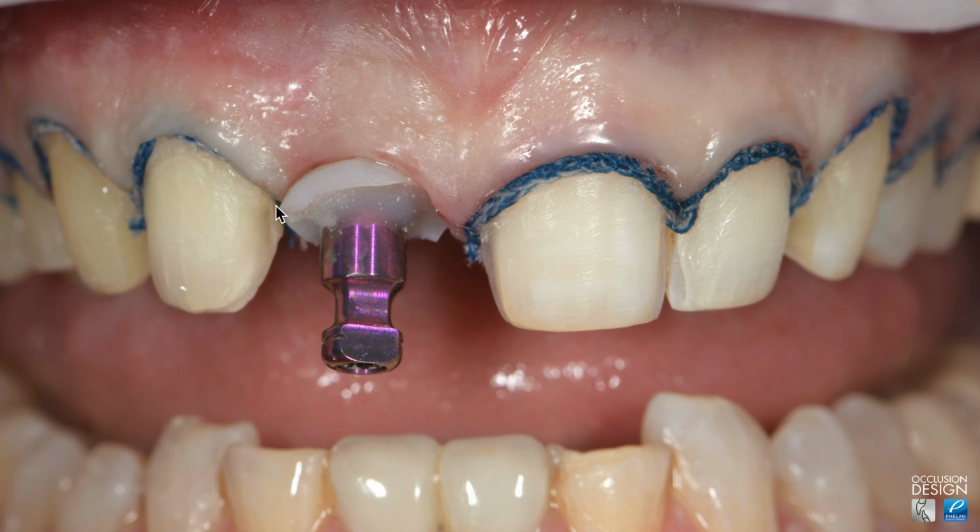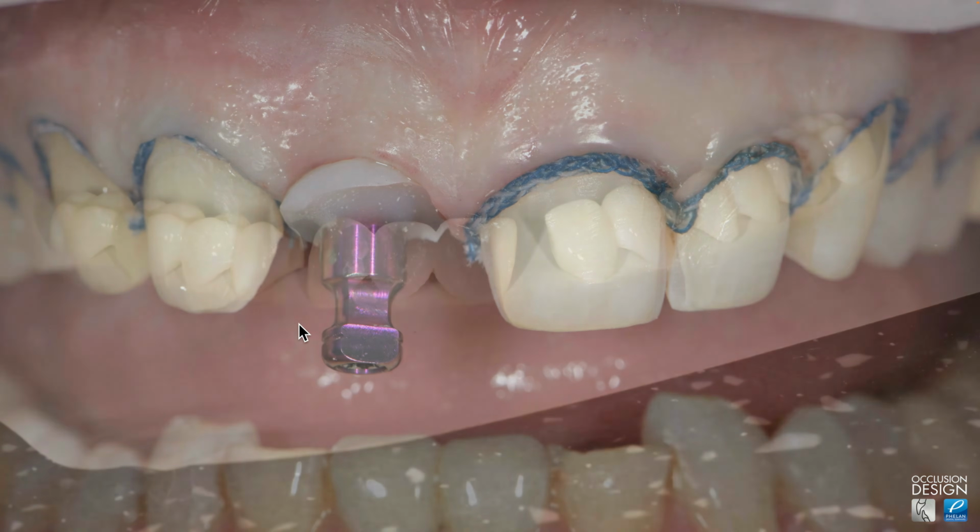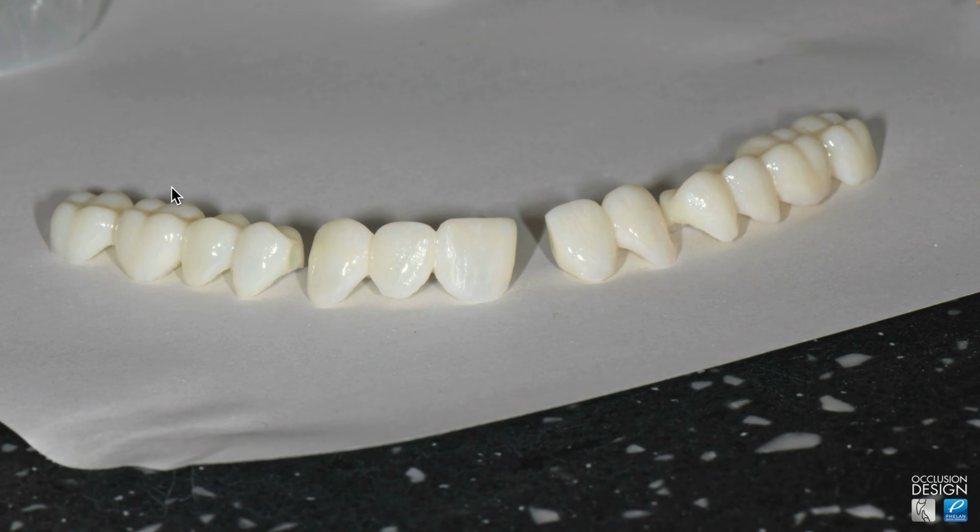This is a custom impression transfer, open tray for the shape that we gained and created with the provisional, the changes to the provisional. Now here's the rest of the provisionals. I've sectioned it into sections. Most notably, the posterior are all one section on each side, so I can remove these to take the bite record at a later date.